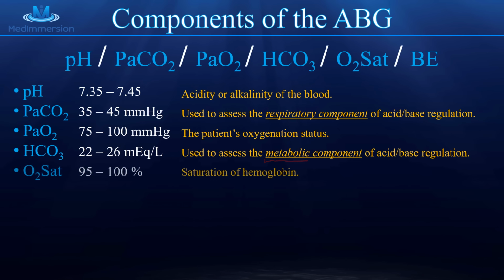The next one is the oxygen saturation of hemoglobin. And this normal value is between 95 and 100. And this is actually the main oxygen carrying component of your blood.